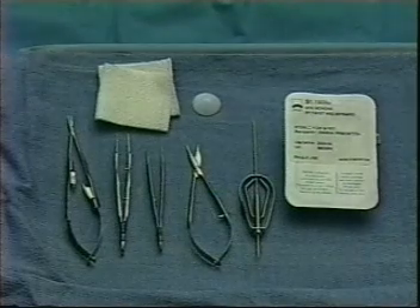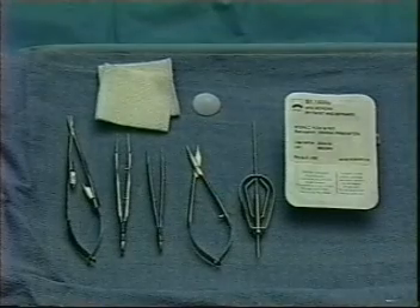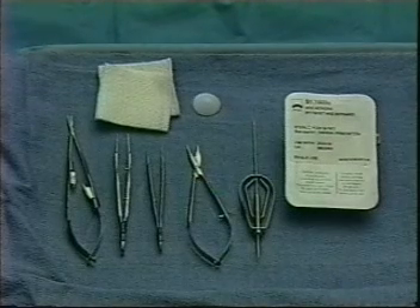In this video, we will show you how to repair a canalicular laceration using a monocanalicular silicone intubation system. It is done under local infiltration anesthesia in the office or emergency department.